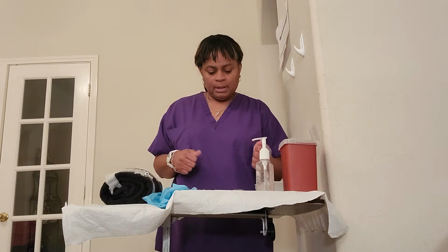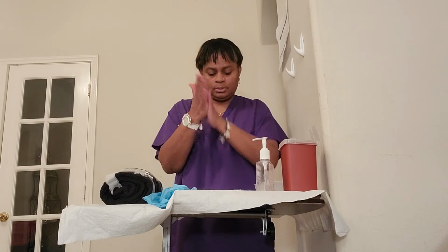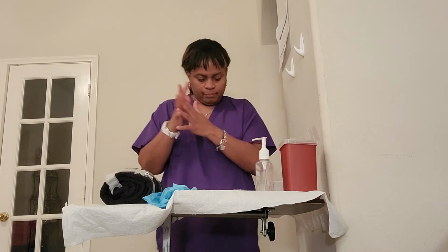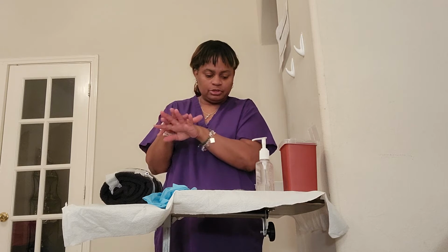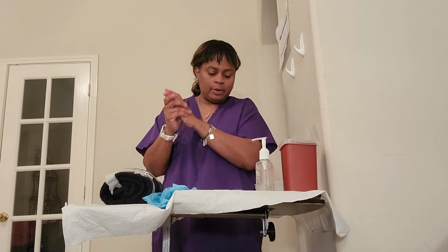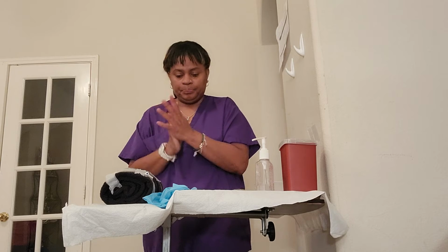And then I am going to go ahead and go to her room. This is going to be 500 milliliters, and it's 125 milliliters per hour that we're administering, and it's going to be 21 drops per minute.